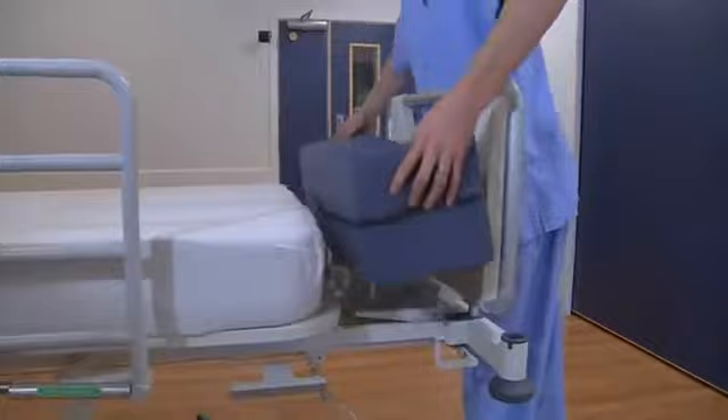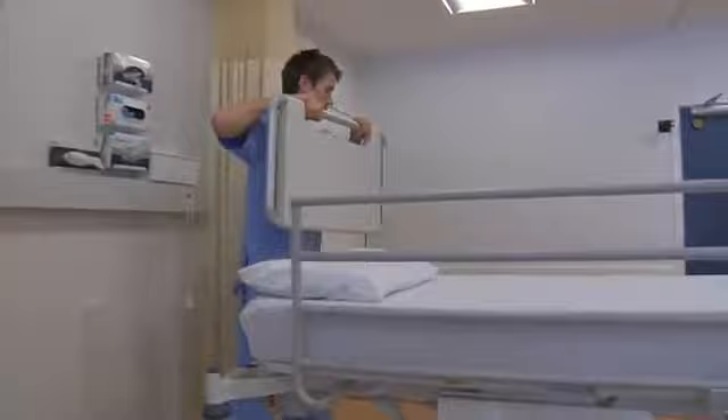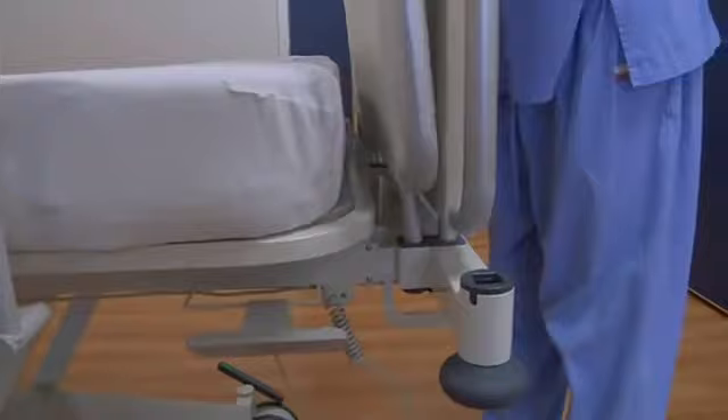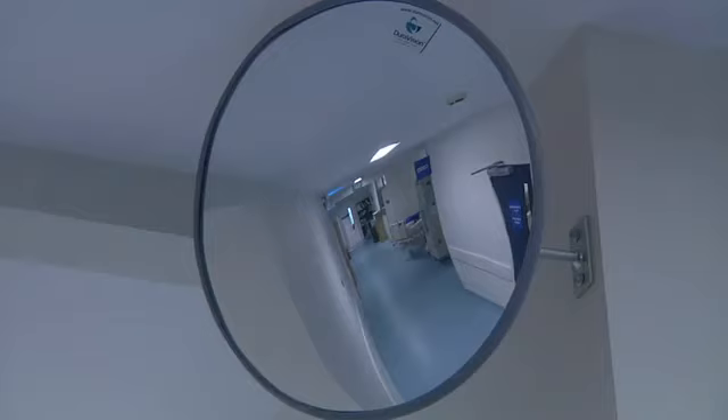Other handy design features include an integrated bed extension for tall patients, a pull-out linen rack so clean linen can be hygienically stored at the foot end of the bed, and the ability to store the headboard at the foot end, allowing easy access to the patient's head and shoulder area. The onboard rechargeable battery means the M9 can be unplugged, its power cable neatly folded away, and the bed used anywhere without having to be connected to an external power source.